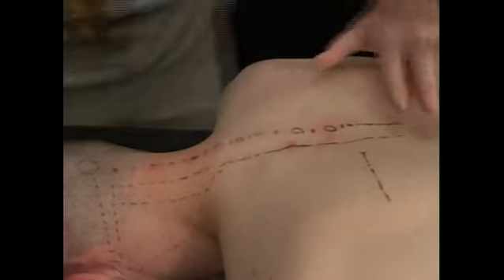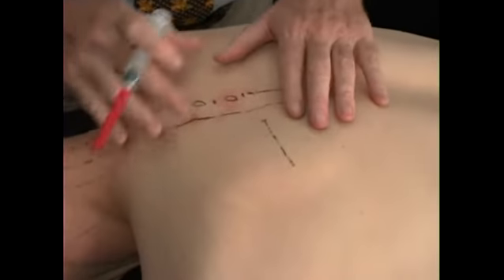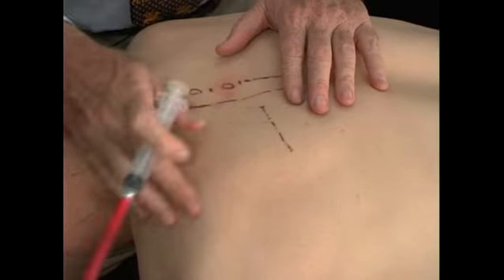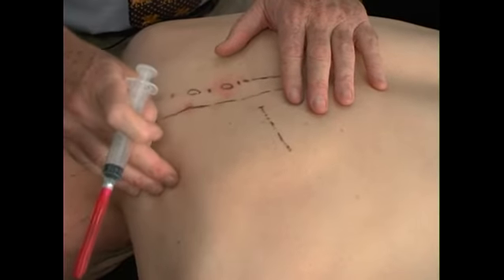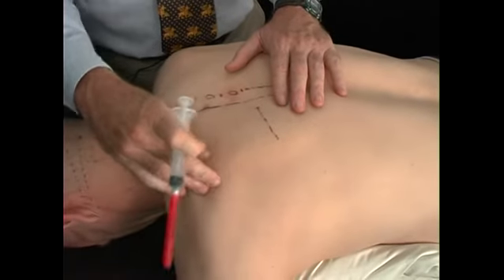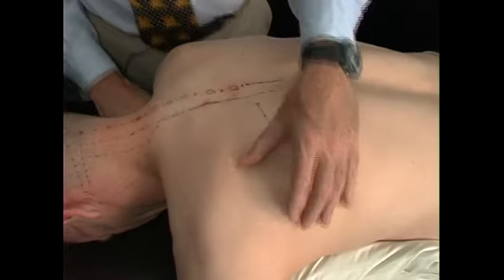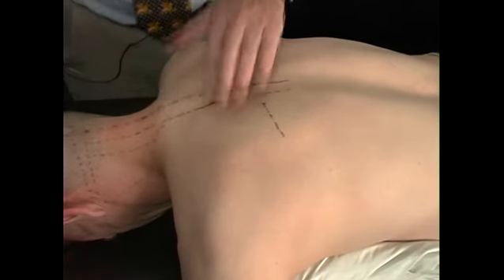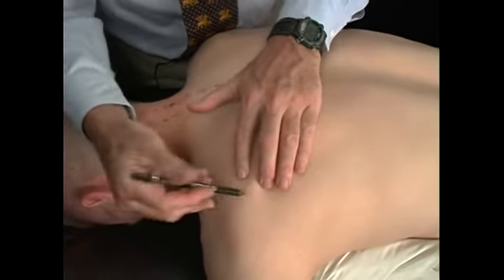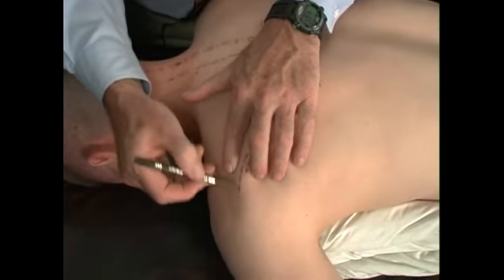Our next series of injections in this area involve the ribs. In the upper thoracic area, the ribs can be quite difficult to feel. They get buried in the trapezius, they get under the scapula, and so we want to identify the border of the scapula. And so we can see the spine of the scapula right here, and just mark a line on it.